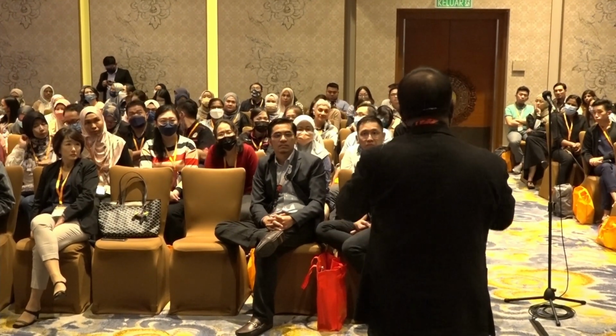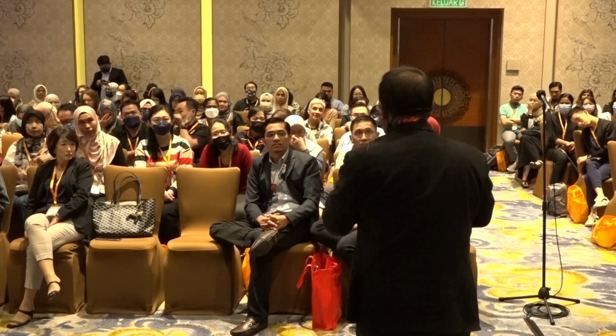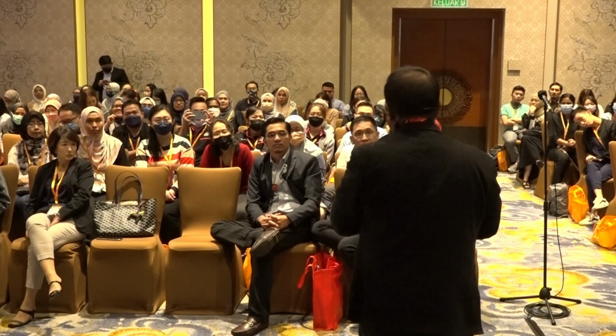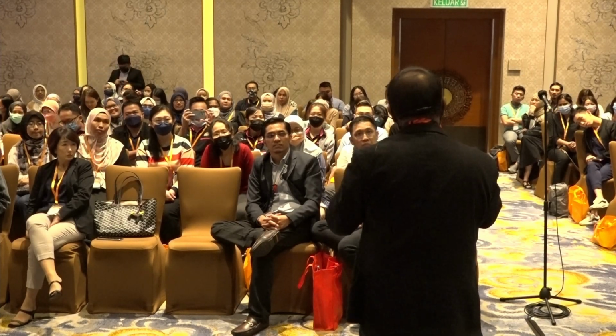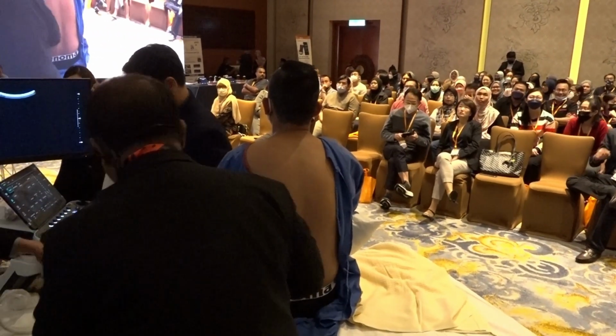So we will do the sagittal scan and the transverse scan. I will show you the anatomy. I will also show you why I have abandoned the sagittal scan, because of certain reasons, and why the transverse scan may be better and more reliable. Okay, so let me show you the transverse scan. Let's do the linear probe first.